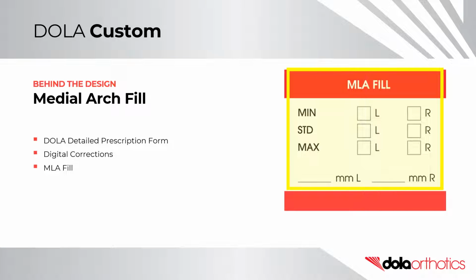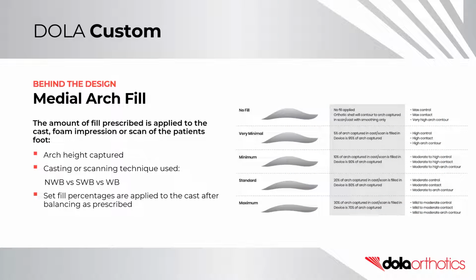They used the MLA fill section of the digital corrections section of the DOLA prescription form. The amount of fill prescribed is applied to the cast, foam impression, or scan of the patient's foot and will influence the outcome of the orthotic design. The outcome is dependent on the arch height captured in the scan or cast or foam impression, and the casting or scanning technique used, whether it's non-weight bearing, semi-weight bearing, or weight bearing.